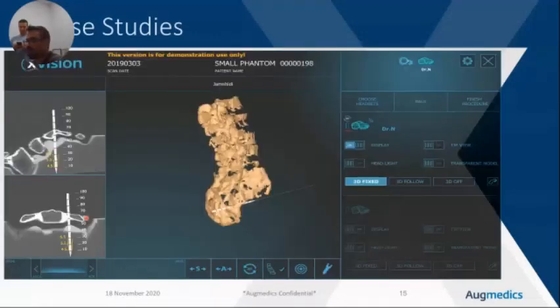As an example, we can see our workstation application rendering the 3D scene right in the middle, where you can see the laser and the 3D anatomy in this example. Qt 3D provides a high-level API that enables us to create a 3D scene without implementing any OpenGL from scratch, like I used to do in the past. In addition, Qt 3D has a set of default uniforms exposed to GLSL shaders if you are programming any shaders. So again, very convenient and saves you tons of time.